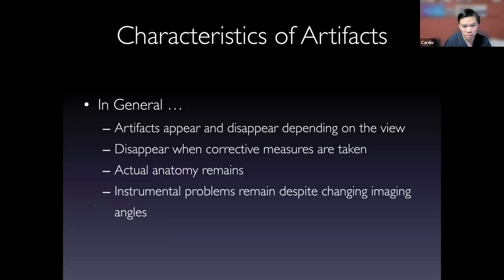But I think these problems occur much less now, because the system is so sophisticated that if it actually breaks, the whole thing breaks down. So it's just nothing, as opposed to all these weird structures. But it doesn't mean you don't have to be aware of the instrument that you use that can cause problems and artifacts.